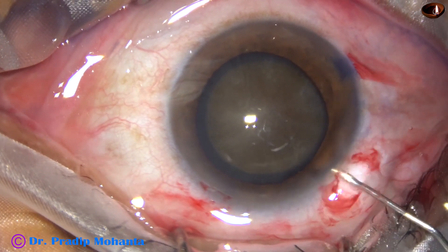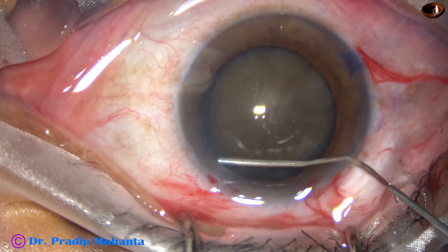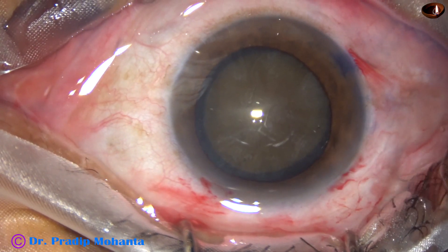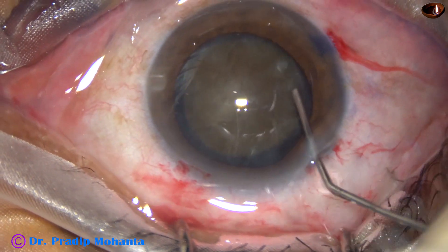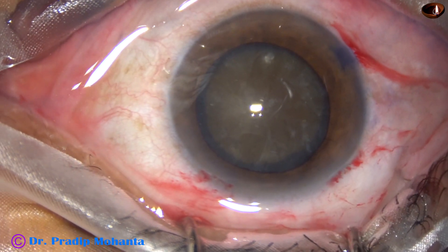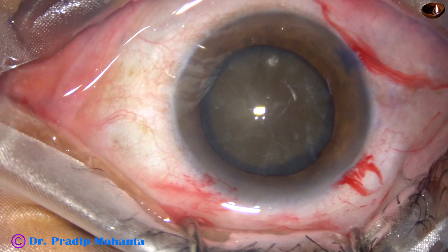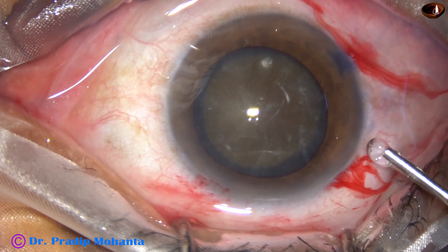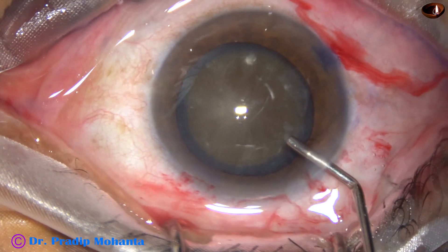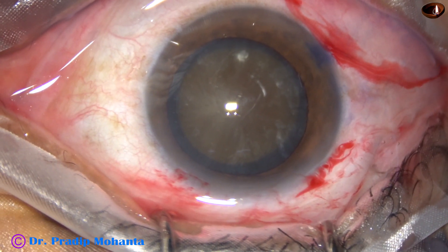Hydro-dissection is being done. A little bit of fluid is injected at multiple points. The nucleus is rotated. Some more visco is applied at this stage. This is 2% HPMC.